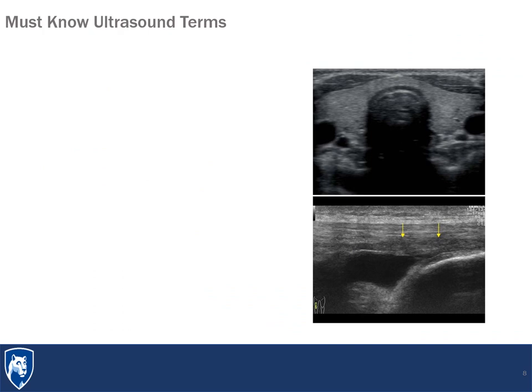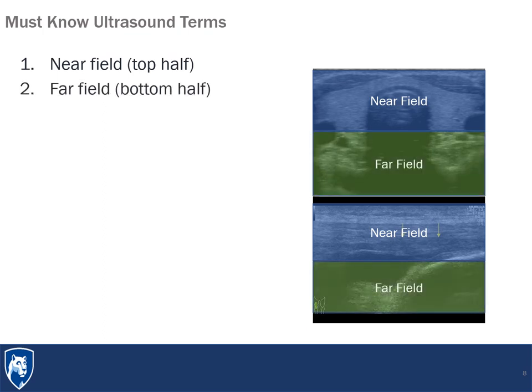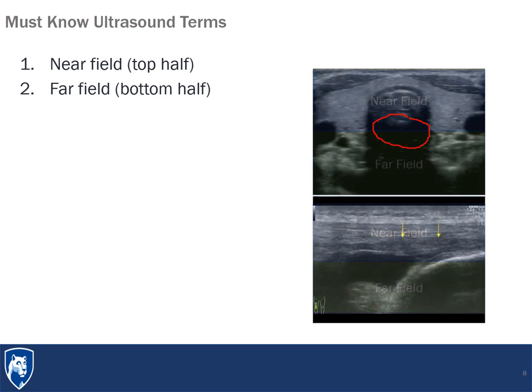Now let's talk about the ultrasound terminology that will help us understand and interpret images. First, we'll talk about the images that are created. So here we can see two images, one of the neck on top and one of a knee down below. If we think about the image itself, we think of the near field being the top half and the far field being the bottom half of the image. And the focal point for the machine tends to be in the middle, although with a more expensive machine, you can change this with some of the buttons and knobs.